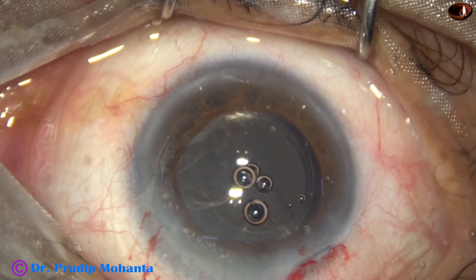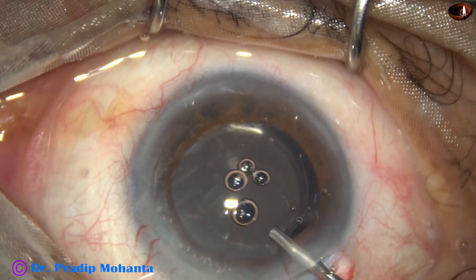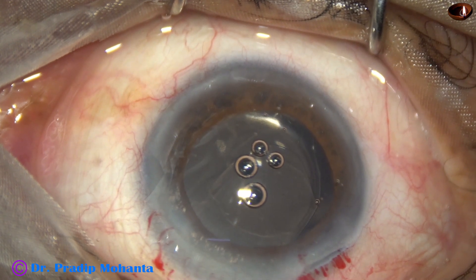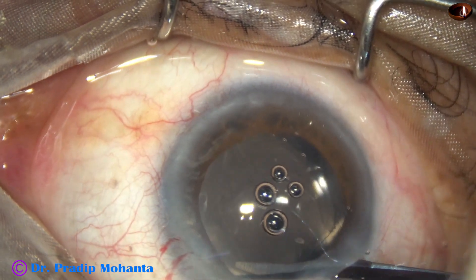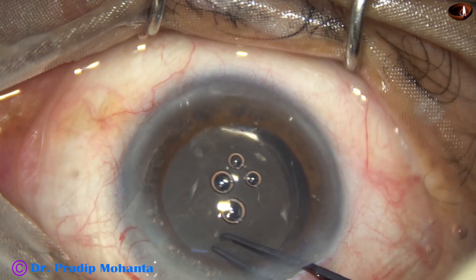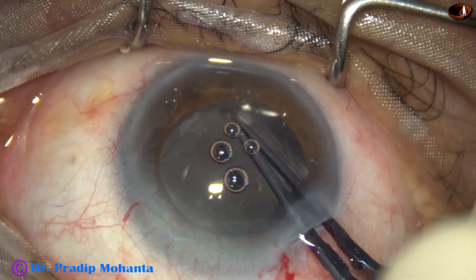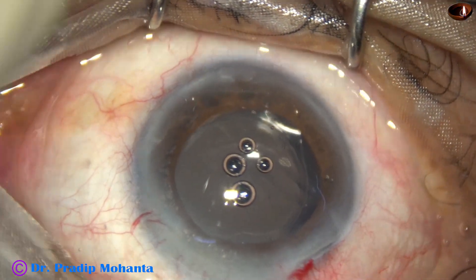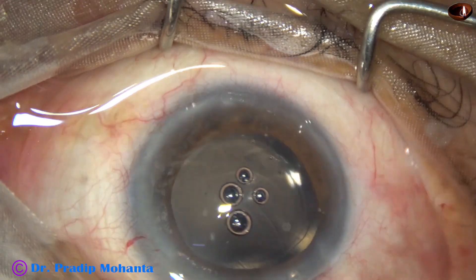The size of the rhexis is about 5 mm; I am trying to make it 6.5 mm to prevent capsular phimosis. I take a Vannas scissor and make a small cut at around the 12–1 o'clock position, then take the Utrata forceps again, hold the flap and go clockwise, enlarging the rhexis along the margin. The rhexis has now become about 6 mm.